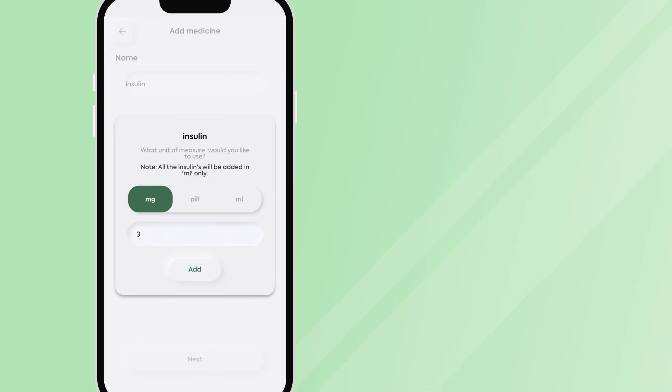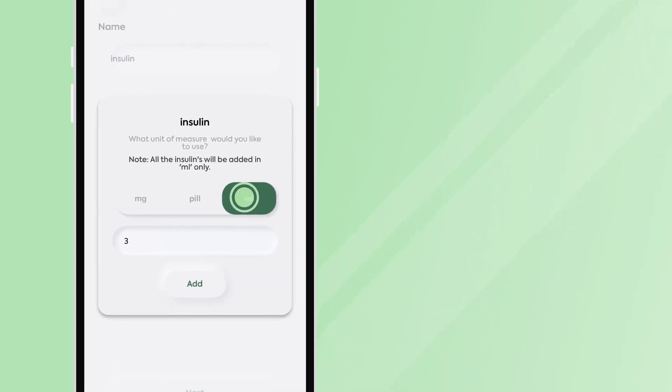When entering your insulin measurements, please make sure to choose the milliliter option. It will not work in milligram or pill.